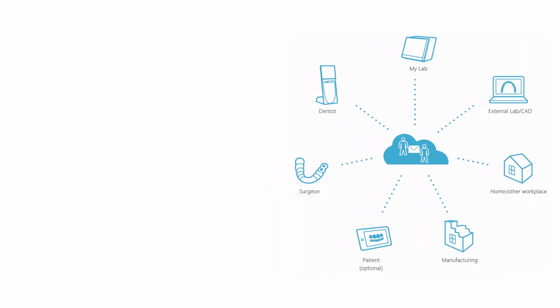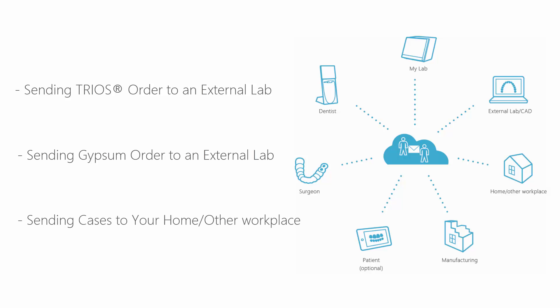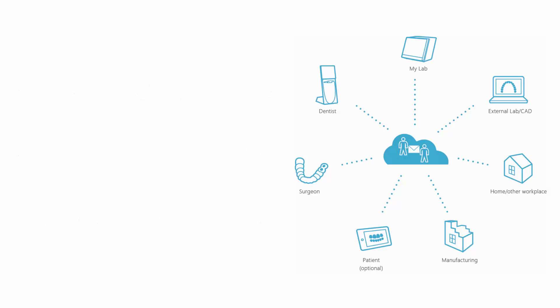We will show you three scenarios: how to send a TRIOS order to an external lab, send a GYPSUM order to an external lab, and send cases to your home PC or other workplace. Let's explain the first scenario, getting an order from your dentist and forwarding it to an external lab.